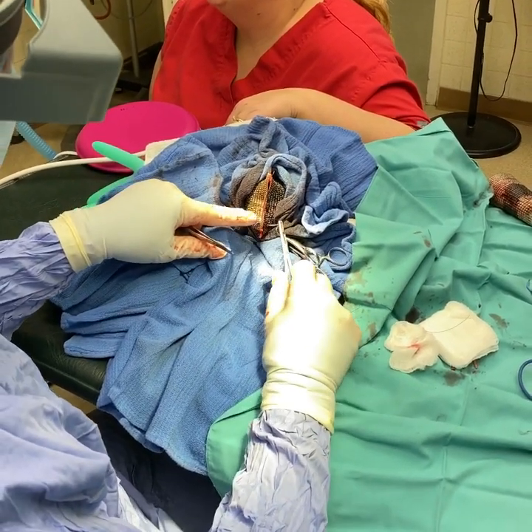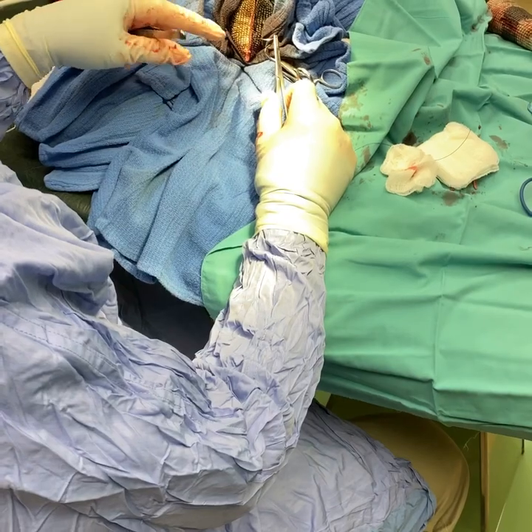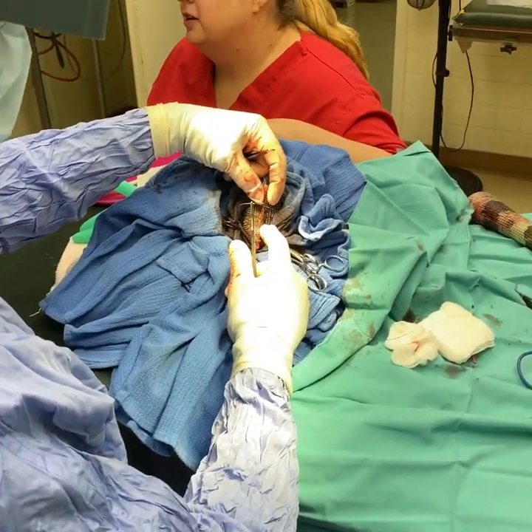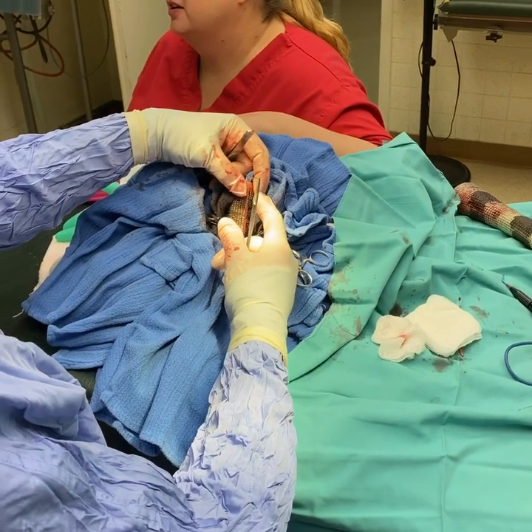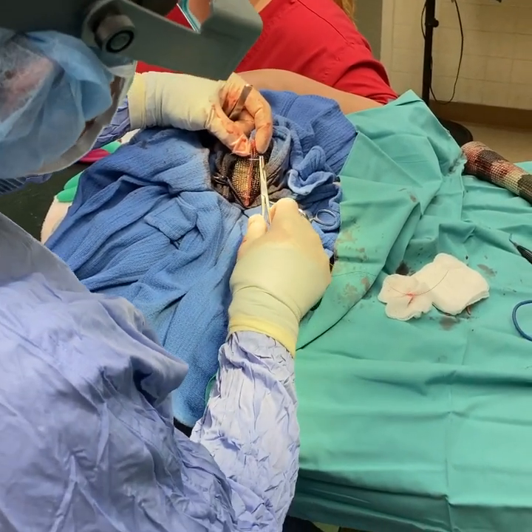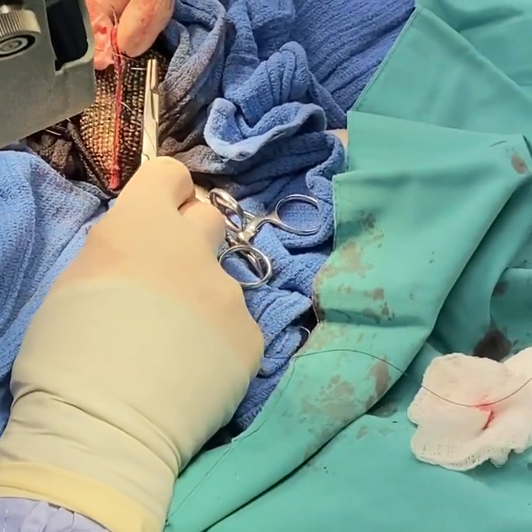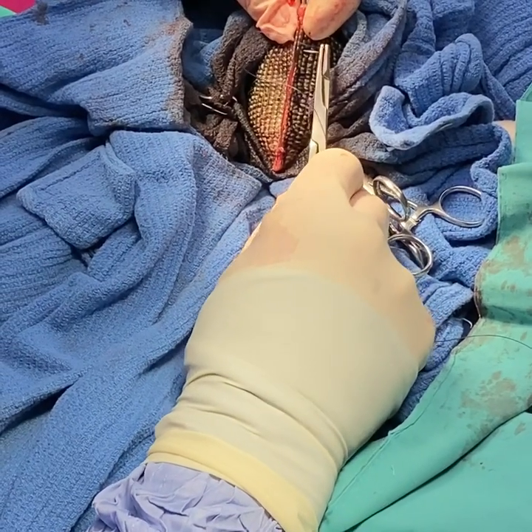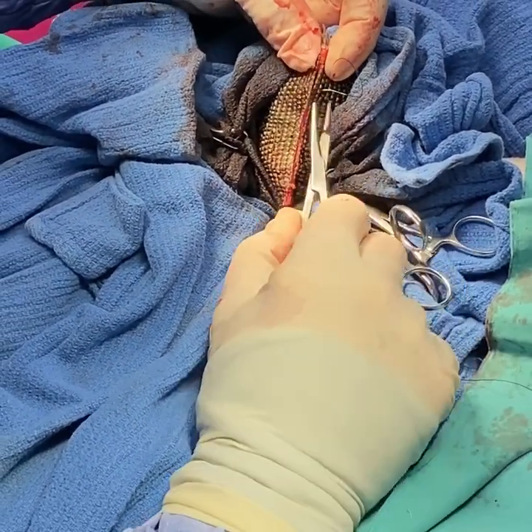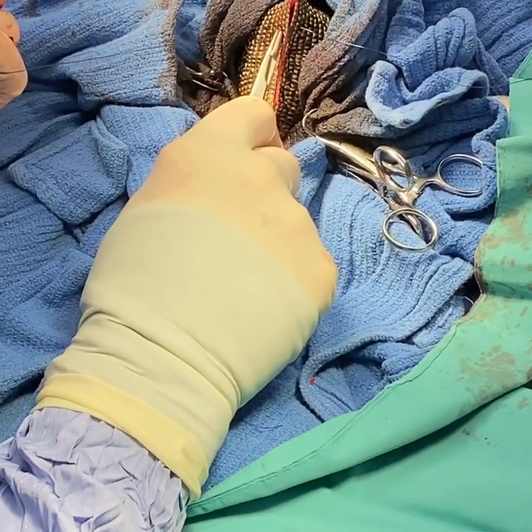We're closing the incision with a mattress pattern so that it everts the skin edges. Reptile skin tends to want to invert and it's best that it doesn't during healing, so this pattern allows it to evert out. When you put the suture in, you want to try to go between the scales as you did on the incision, because puncturing the scale itself is not ideal — between the scales, as you can see right here.